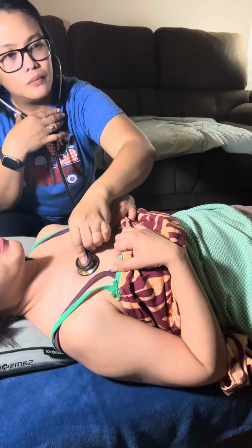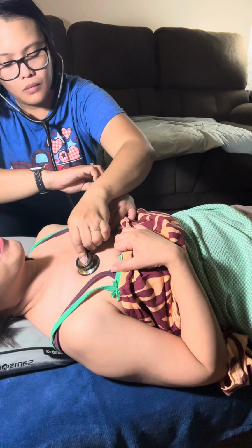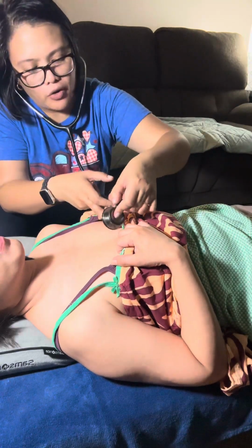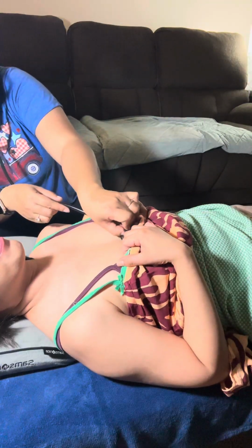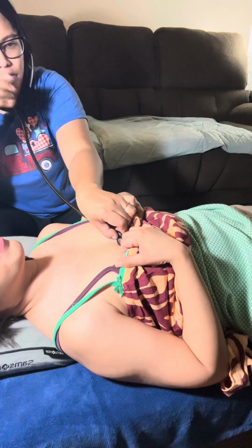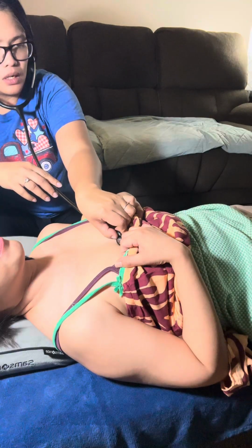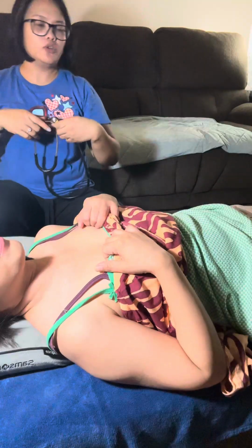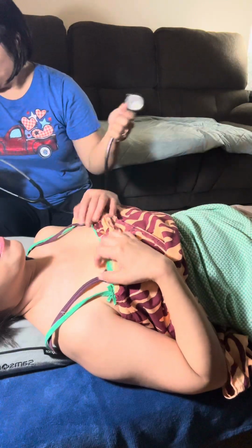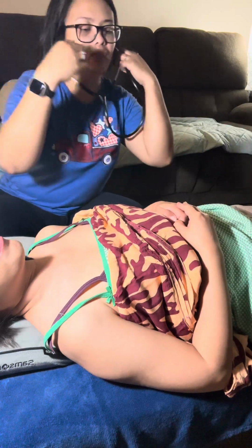Pulmonic. S1 and S2 is heard. No extra sounds, no murmurs. Rate is regular. Tricuspid, S1 and S2 is heard. No murmurs, no extra sounds. And also I don't hear any thrills. Next is the mitral, which is at the 5th intercostal space.